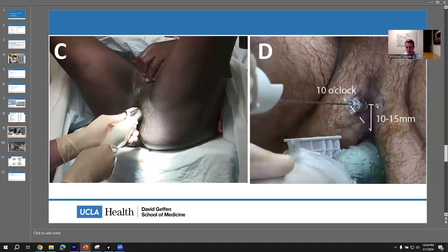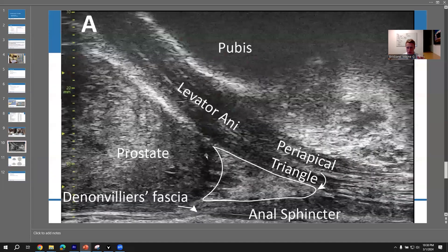Basically I put a stick puncture local at two and ten o'clock, and then I advance the needle guide in at those positions. The ten o'clock one is going to be accessing the right apex, the right prostate. The two o'clock one is going to be accessing the left prostate. So first that inch and a half needle goes in, pokes right there, and instills a wheal. Then under the skin, put a wheal at the contralateral side — so the patient is only experiencing one poke. Then you're going to advance along the superficial tissue. Let me show you this on micro ultrasound.